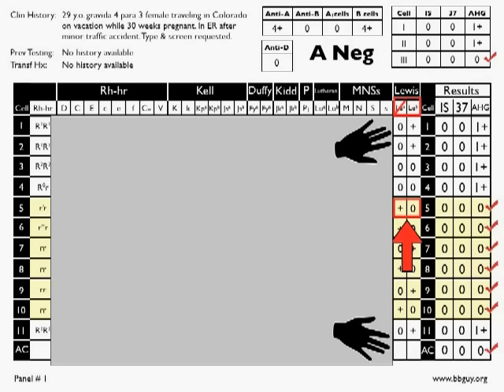Now, there are people that would argue with me on that, and that's okay. If you want to look more, that's totally fine. From my perspective, I've done a lot of these, and I have not seen a situation where that has led me down the wrong pathway. But blood bankers are very compulsive, and they like to look at everything, so that's totally fine if you want to do that. My advice to you, if you're on an examination in particular, don't do more than one double dose rule out because you're wasting your time on an exam. In the real world, maybe live up to a higher standard.